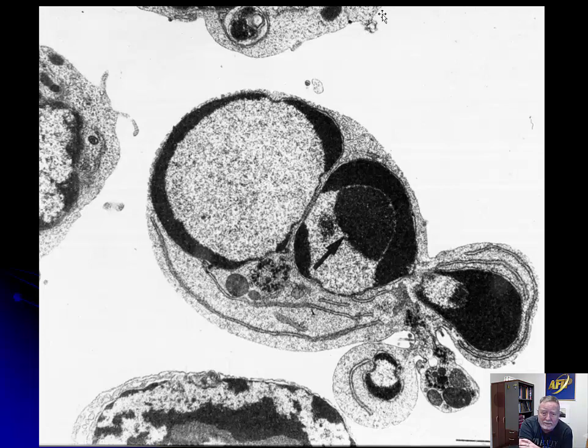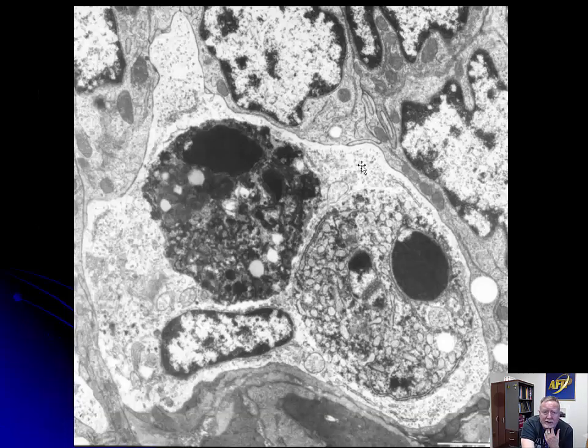And then up here, this may be a phagocytic cell, like a macrophage. It has engulfed one of these little blips of a degenerating cell, and it's starting to break it down. Notice how everything's starting to get blacker and blacker and blacker, and that's what happens until it's just a big blob of lipofuscin or spheroid. Okay, great preservation in a cell that's breaking up. We're dealing with apoptosis.